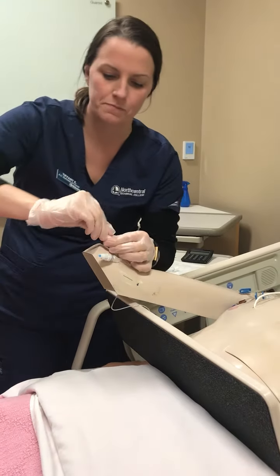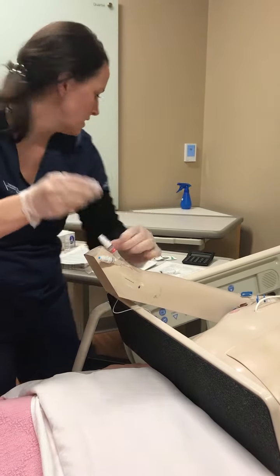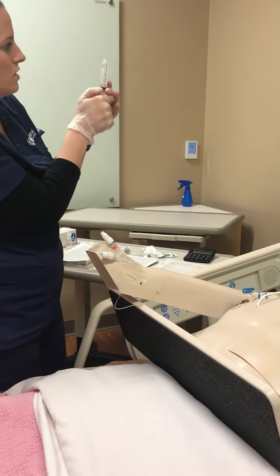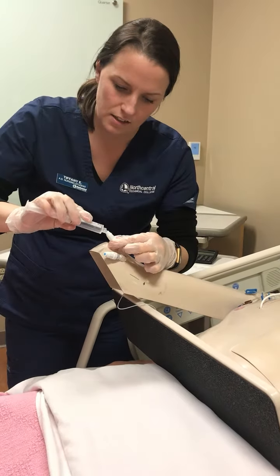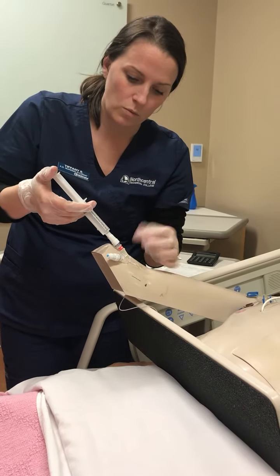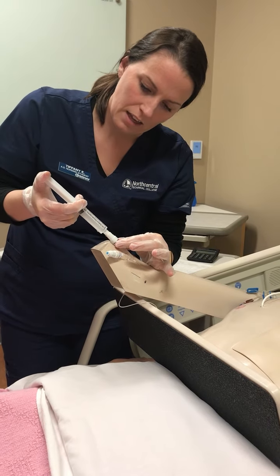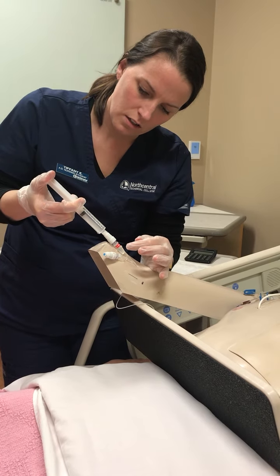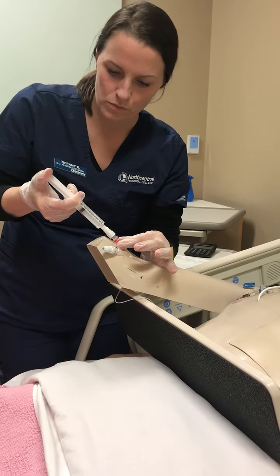Clean the site again, per agency policy, 30 seconds. And then I would go ahead and make sure again that this is within expiration date. I would release any of the air and attach, making sure I would unclip here when I'm attached and ready to be using it. And then I would flush. So I would flush this at the same rate as I would the Zofran.